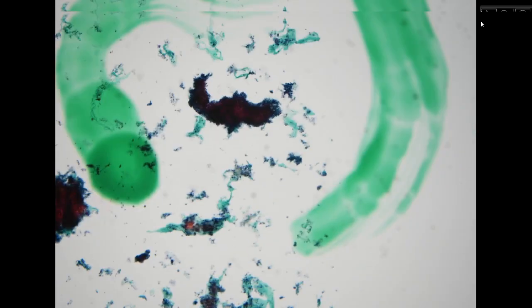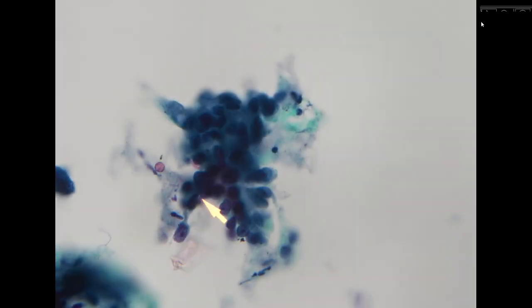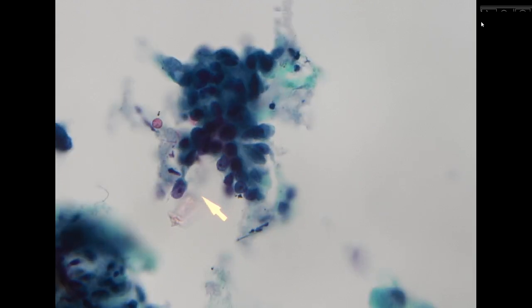We have a couple of EUS guided pancreatic aspirations. For the first specimen, on low power, you can already appreciate that the background seems to be quite dirty. We have a lot of necrotic debris. When we go to higher power, these clusters of cells definitely show clear nuclear atypia with very hyperchromatic chromatin. But here we can still appreciate prominent nucleoli. This is overlapping with a very disorganized arrangement. So this is consistent with an adenocarcinoma.